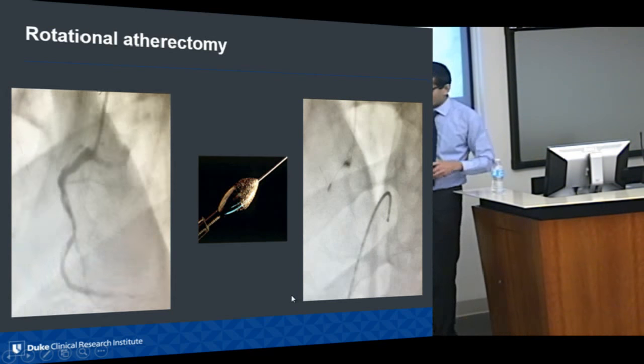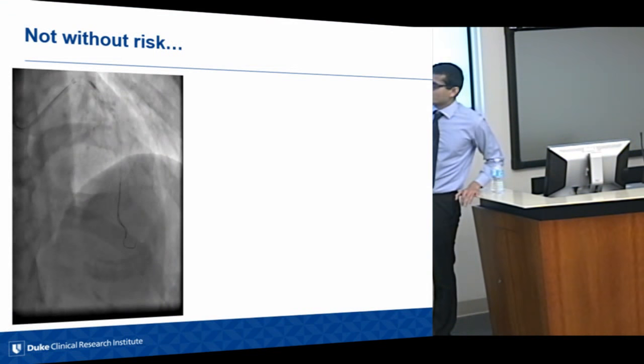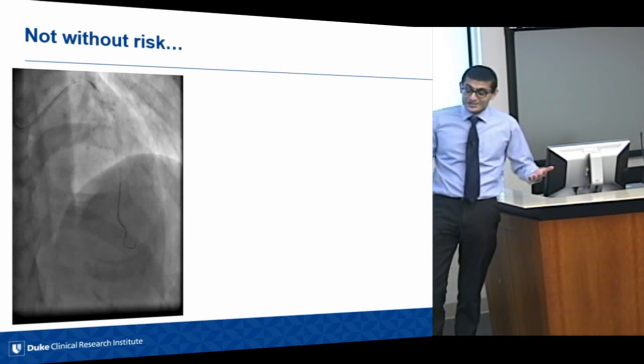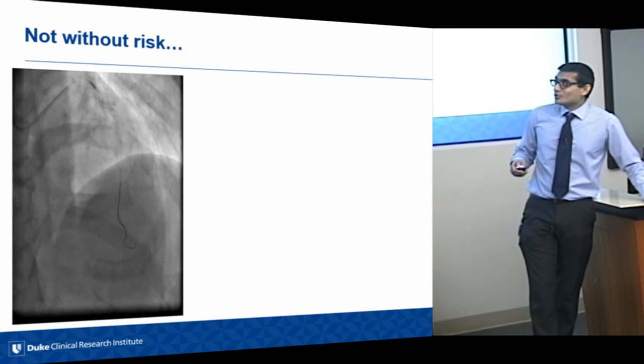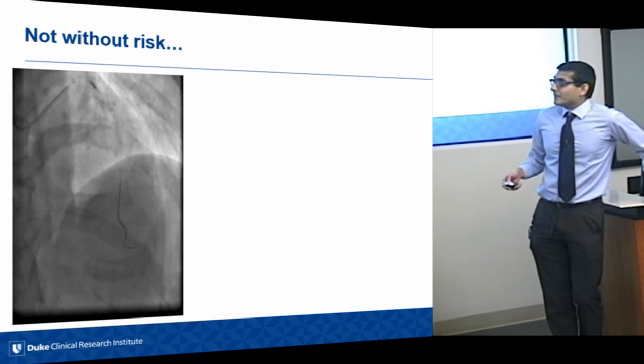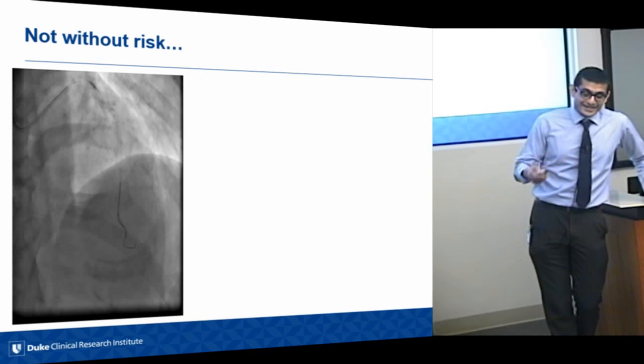None of these procedures are safe or without risk. Most of them are safe, but none of them are without risk. And the two most common complications are dissection and perforation. And so dissection essentially is a tear within the artery.